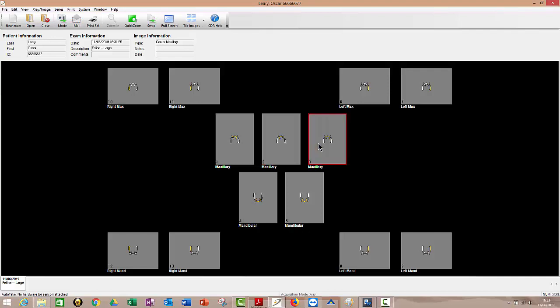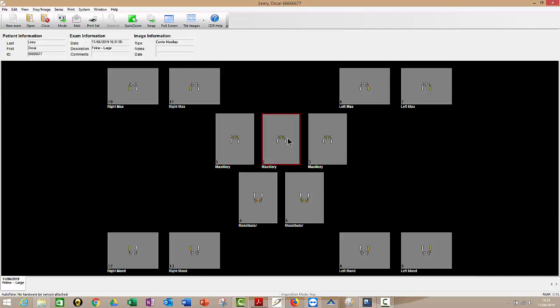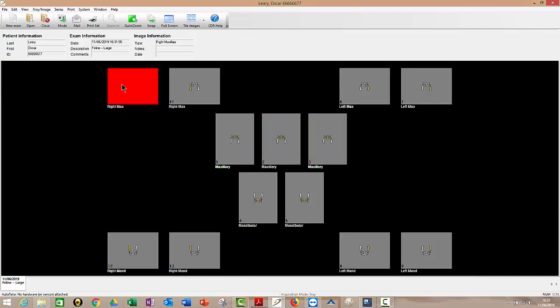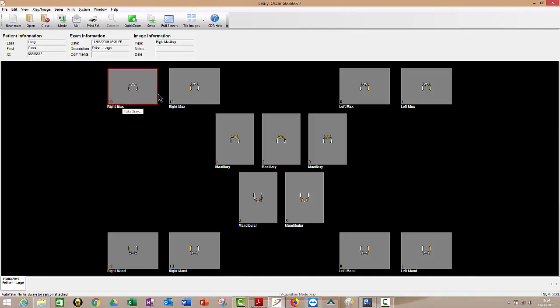So with the cat, that's what I normally do. We normally start with the cat in sternal recumbency and do the right canine. Then it would automatically jump to the incisors and the left canine. And then we would do the upper right maxillary. And I would always choose this box here, so 10 rather than 11, because the image will capture in 10. But if I haven't quite got the angle right, then box 11 would be flashing for me. And without me going back to the PC, I will have two images from the right maxillary area.